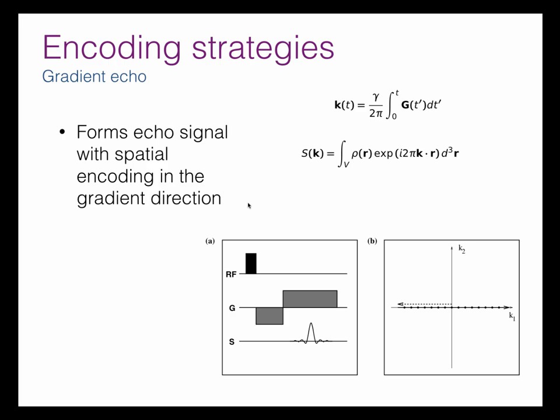Okay, so remember our gradient echo. This is going to turn out to be quite useful now, because if we apply our gradient echo formulation, which we had a little while earlier, we can play our RF excitation here, and then we can apply a gradient pulse and then reverse the gradient and bring it back and make this gradient echo. And now we can kind of see why you get this echo signal as well. Remember g is the velocity through k-space.